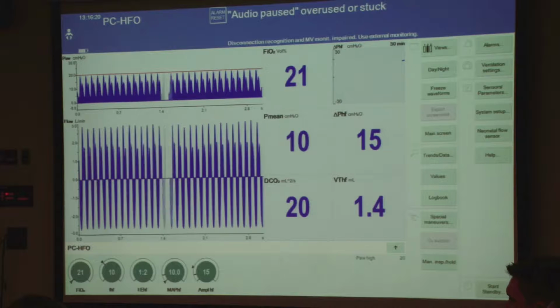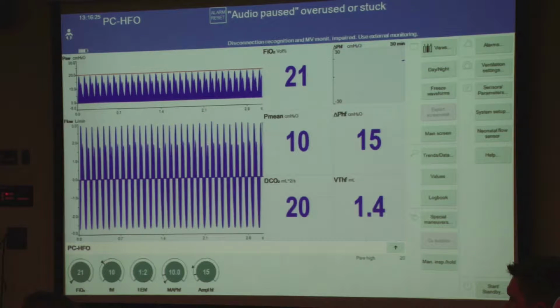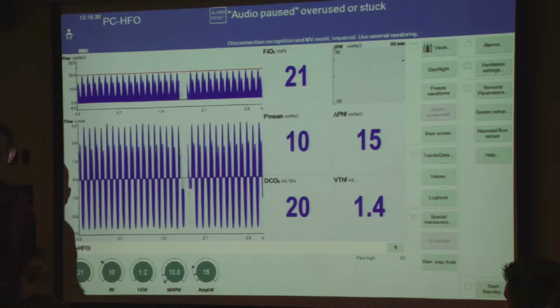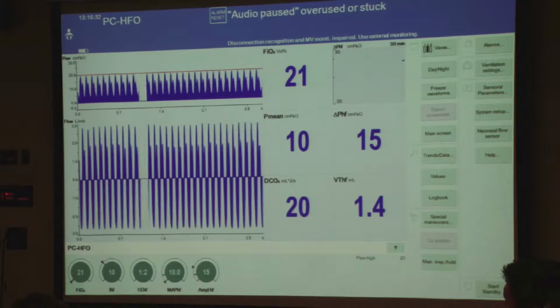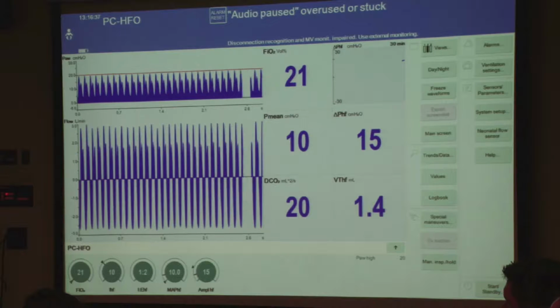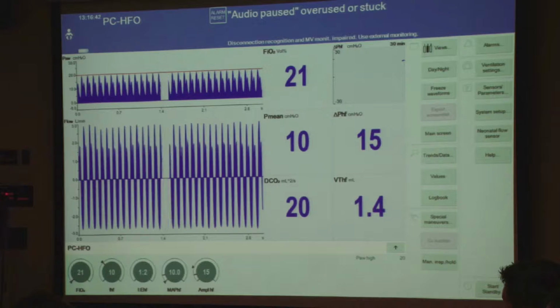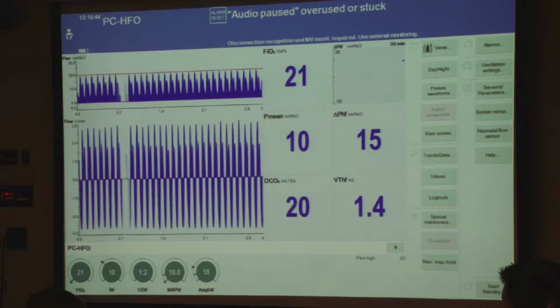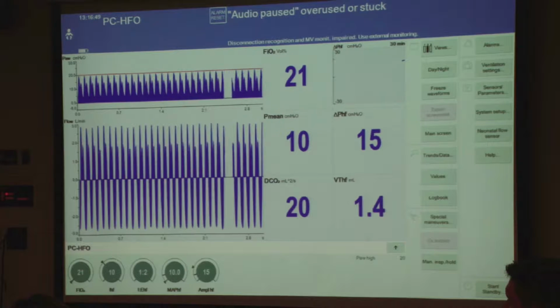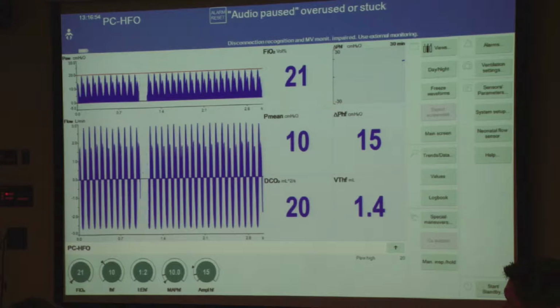And things happen, and the nurse in charge of that patient was also a new person, so two things went together, and she spent all night increasing the amplitude, and things were just not happening. She was applying the Sensormedics recipe to this ventilator, which was the one she knew how to ventilate high frequency with, and it just didn't work. And that's what usually happens. So I'm going to show you a couple of things.